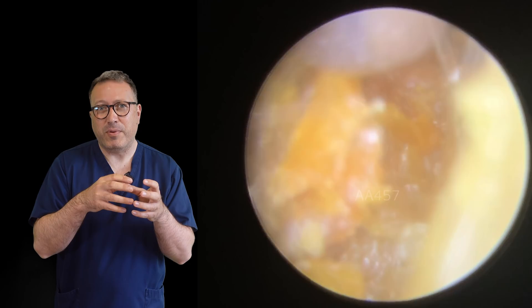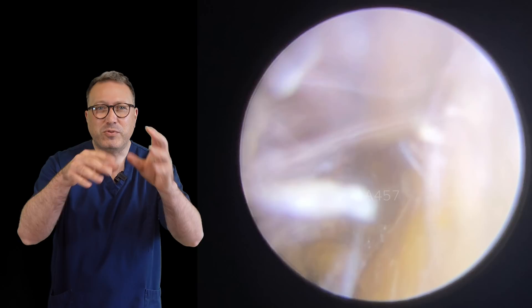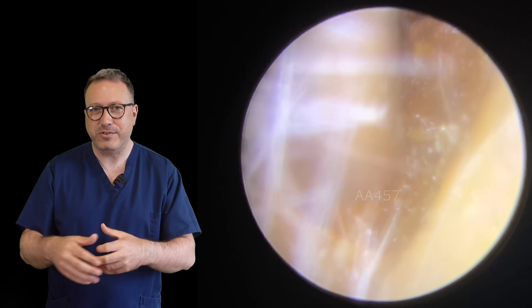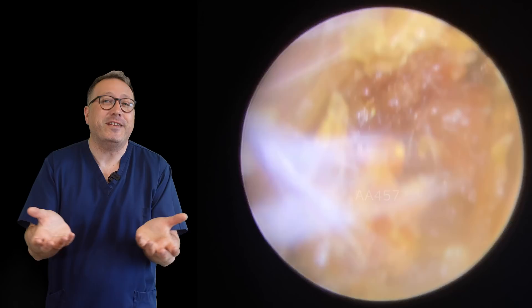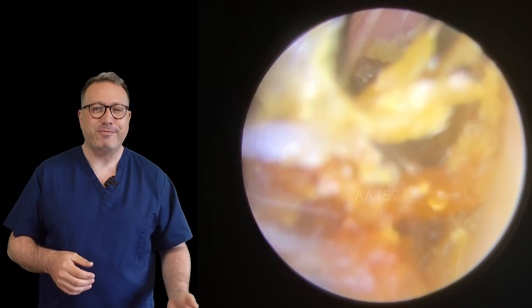Just loosening it all up, but it was quite firmly attached to the canal wall. So this patient did really, really well — an absolute trooper. While we're doing this, I just want to say a massive thank you to you guys because I always find it really difficult to take time away from YouTube — I'm always afraid to let you down by not doing videos. But your messages were so lovely. It was really nice to be missed, and you were so understanding. We really, really needed to recharge our batteries. I was absolutely exhausted — you could probably see that in some of the videos towards the end of last week.